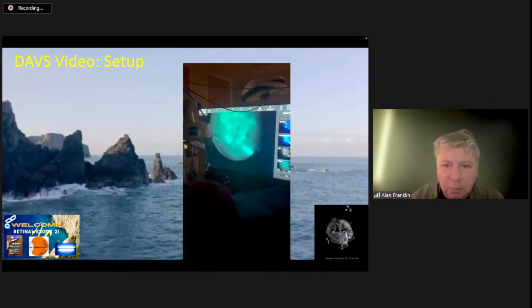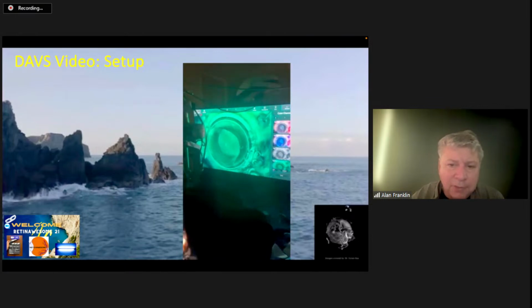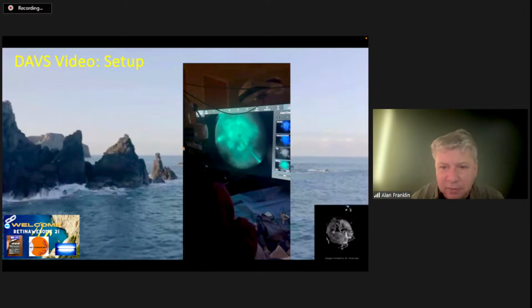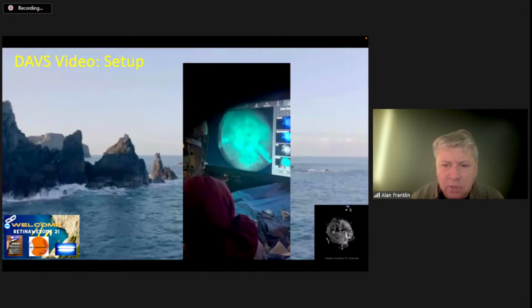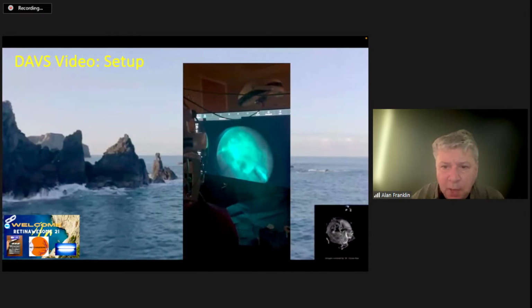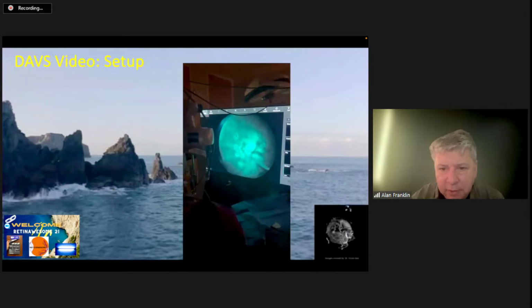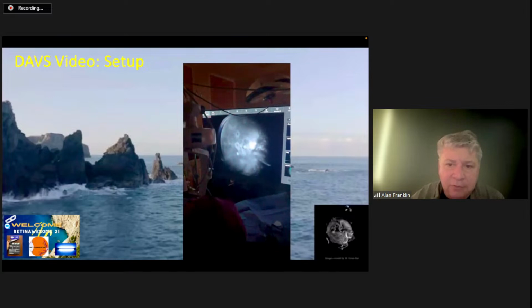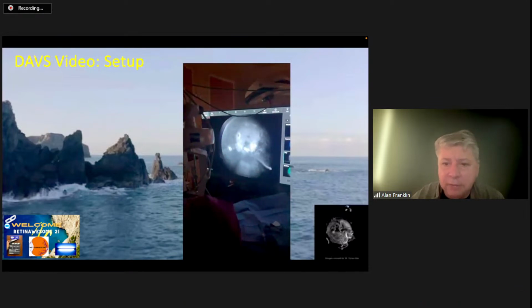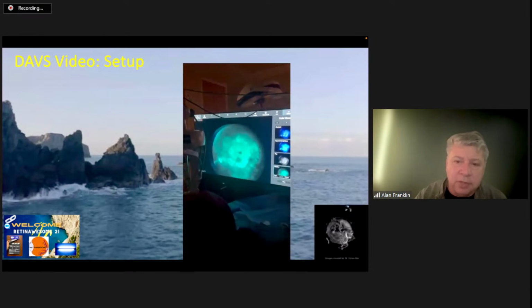And what I'll usually do is put the pressure down from the machine and then aspirate to make sure that the eye is relatively soft, because one thing we've seen is if the pressure's up, there's just no perfusion. So this is a diabetic that's had a bunch of work. As the fluorescein comes in, another minute or so, we'll see along the superior arcade there's some leakage right there. And so within about a minute, we have an answer that we're seeing some residual hot spot or leakage that we're going to go ahead and treat. So it's really very seamless to go to fluorescein imaging and then back to regular imaging in the operating room.